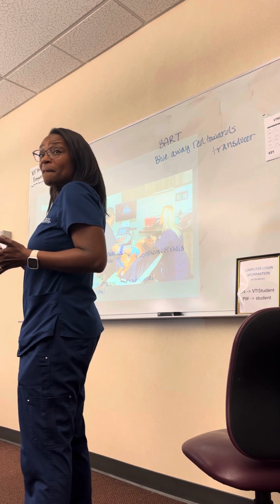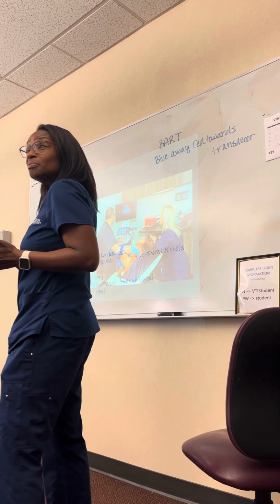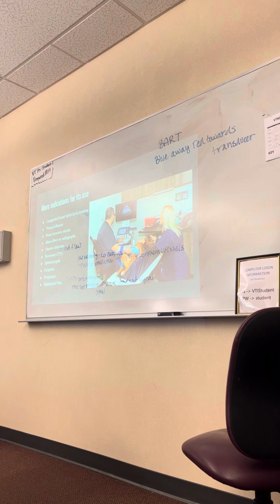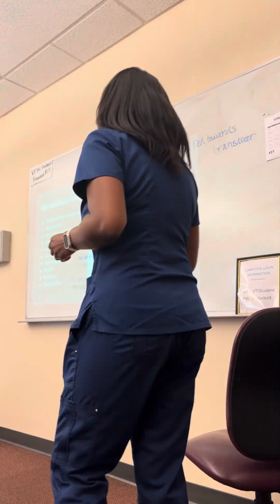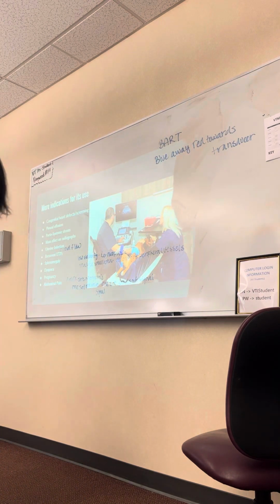Ultrasonography? Was BART for the M mode or was it for the color Doppler? BART is for color. Yeah, so one of the questions is, the image that is produced on the computer screen when using a sector array ultrasound transducer, and that's the triangle one.